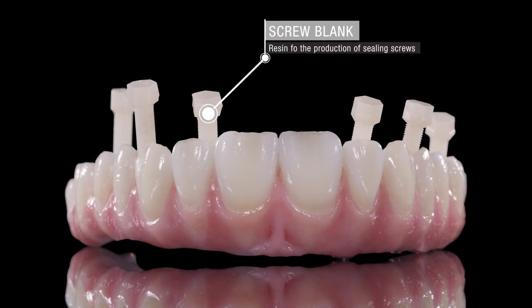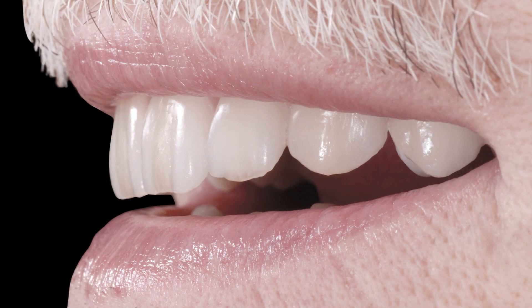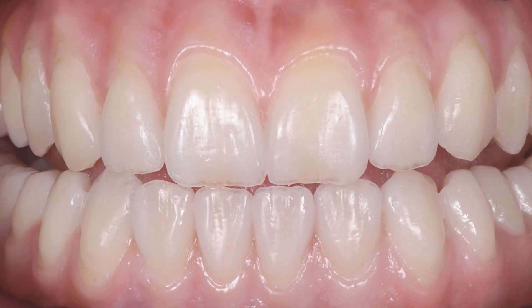The titanium elements were anodized in color and bonded with the Pridot 2 zirconia structures. Resin sealing screws were inserted into the structure to check their fit. During the restoration's insertion, the threaded channels were closed with the resin screws. The final restoration fully met the patient's expectations and requirements.